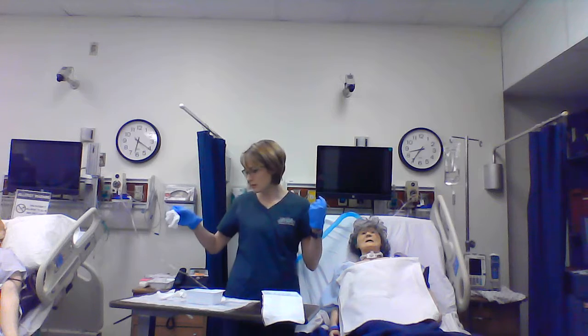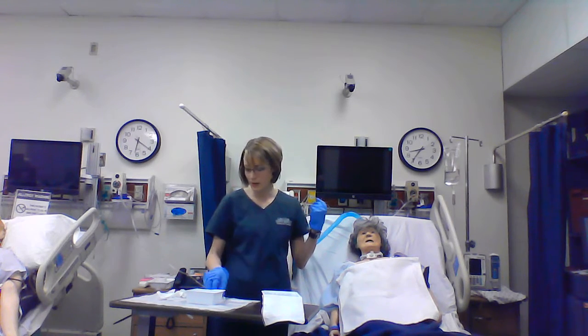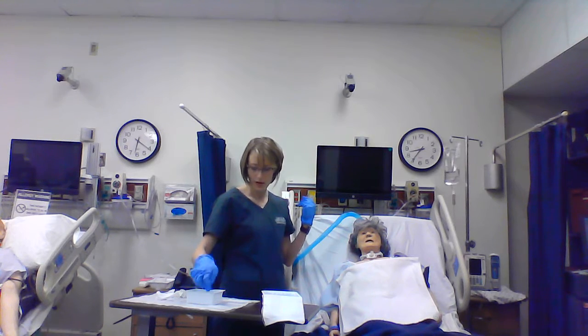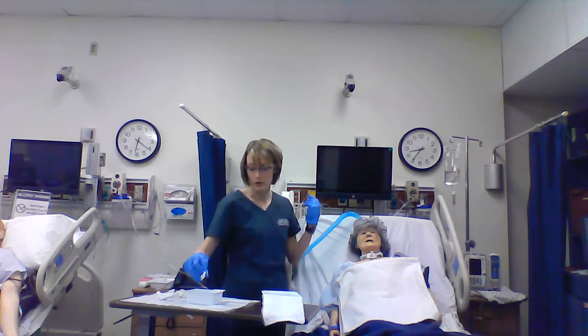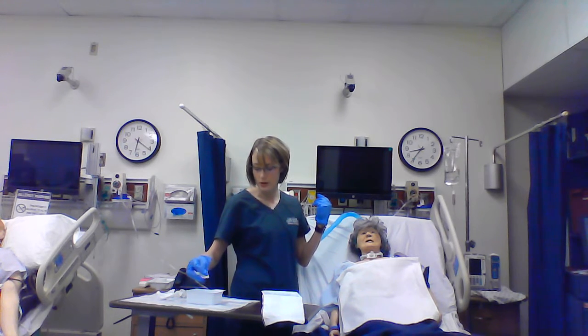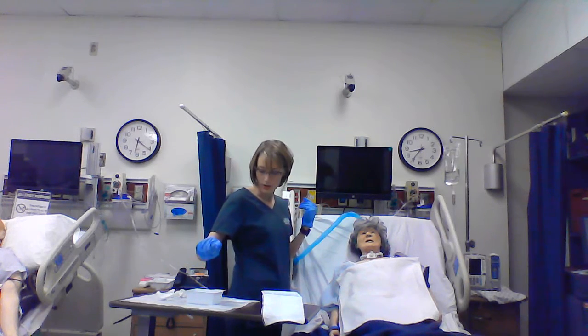And I did that with a contaminated hand. So I would throw those away and get new, soak those just with a sterile hand. I would probably go ahead and doff these and don a new pair of sterile gloves as well, just to make sure that I don't introduce any bacteria into her tracheostomy, since I did touch that with contaminated hands.